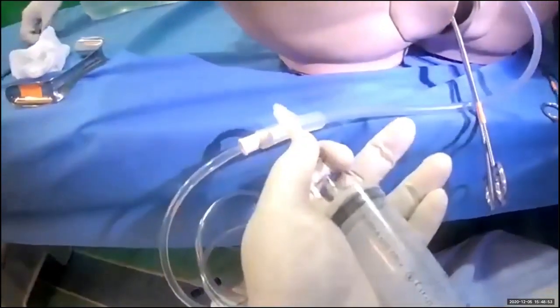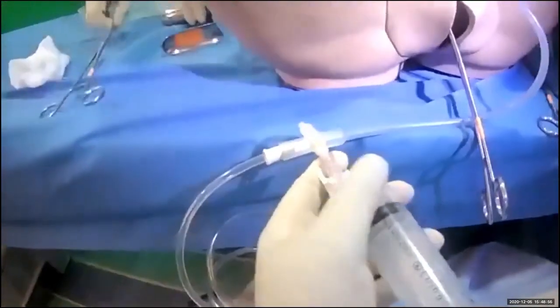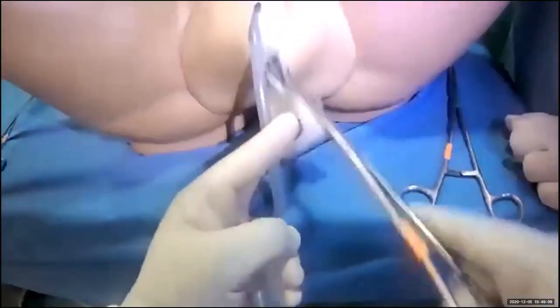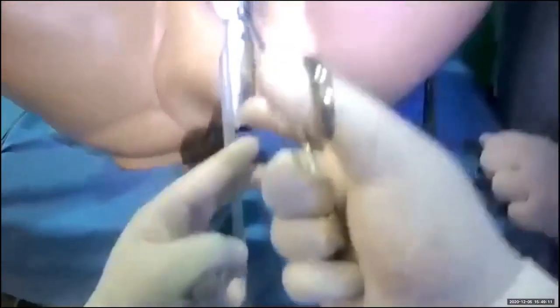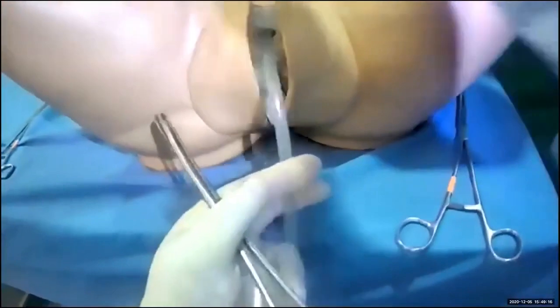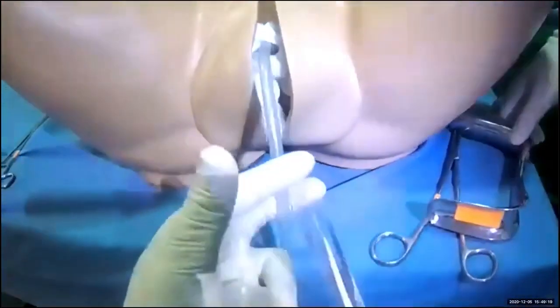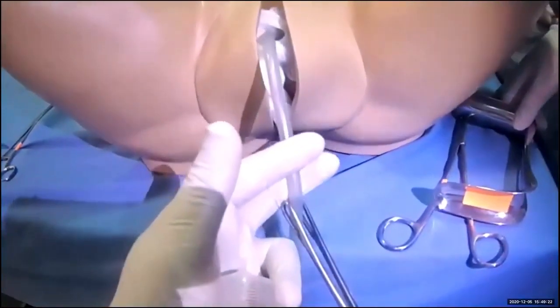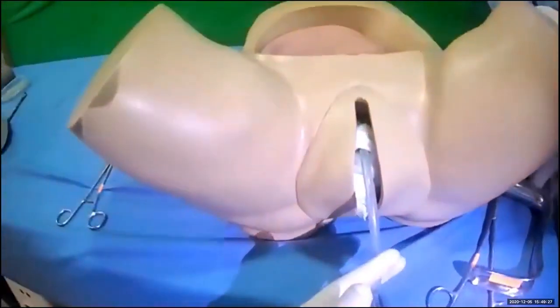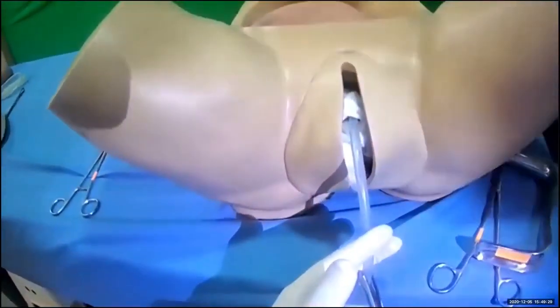I've now inflated 100 cc and the bleeding looks secured. The next step is to pack the vagina. You can use an abdominal pack to pack the entire vaginal cavity to prevent backflow of blood from inside the cavity. Once that is done, continue your uterotonic agents and your antibiotics. Use the MEOWS chart to observe the patient. The balloon is usually kept for a period of 24 to 48 hours until the bleeding stops.